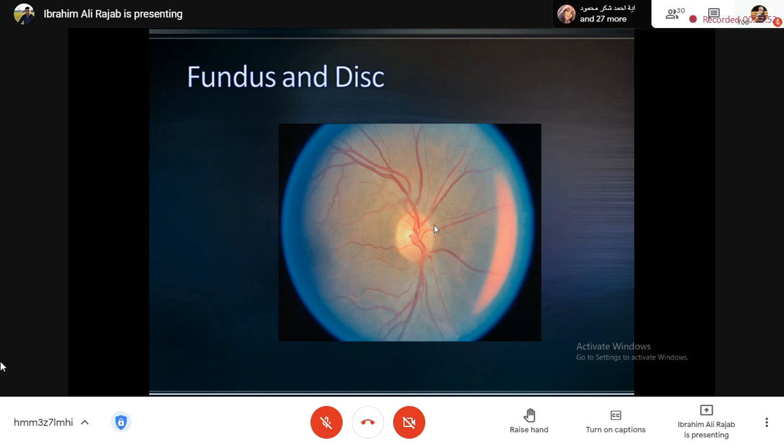شكرا أنفال. يلا أهلا ياسر. Continue the description. دكتور يعني there are no signs of hemorrhage يعني سواء flame hemorrhage or blot and dot hemorrhage. There is no atrophy of the veins. Thank you. Okay, تمام. She looked at the peripheral part of the fundus, the retina, and she noticed that there is nothing to be mentioned as an abnormal finding. So we should go to the next image.